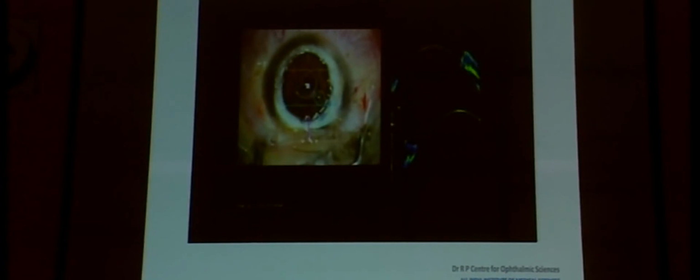So the challenge and the expertise comes in achieving a big bubble in these kinds of cases, in keratoglobus, in pellucid marginal degeneration, where the ectasia is significantly larger and more difficult to deal with, and achieving a significant flattening and a good unaided visual acuity in this patient. So this is a full video clipping of the earlier points which I pointed out in this particular case. And remember, when you do a big bubble DALK, you get a smooth surface, and careful trimming out is very important, as you can perforate if you're not trimming out well. And then you place your donor button on, and the principles of suturing are pretty much the same as in any other patients.